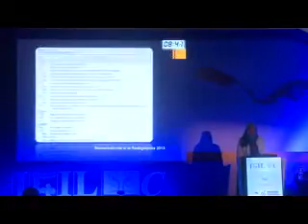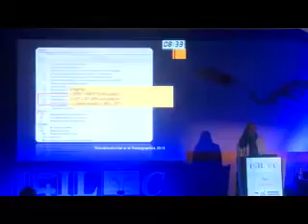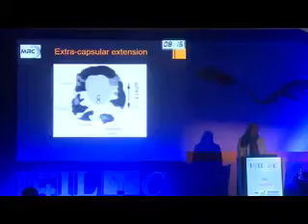In the TNM staging, we play a very crucial role to assess the extraprostatic extension, either involvement of the prostatic capsule or the involvement of the seminal vesicles, and we have proved to have very high accuracy in both items. Also, assessment of lymph nodes, which can be difficult to assess clinically, is our role in MRI, with very high sensitivity as well.